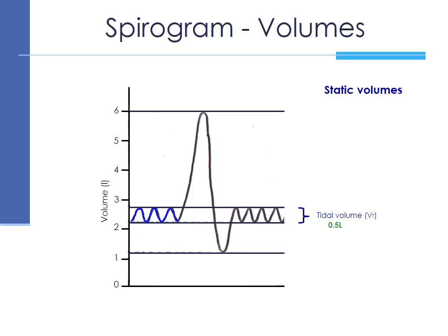Now, the next instruction to the patient was to perform a maximal inspiration. So the maximal inspiration would take place over here. During this part of the maneuver, during maximal inspiration, this would represent the patient's inspiratory reserve volume. In other words, that would be the volume that the patient can inspire after a normal inhalation. And this is usually about 3.3 liters.